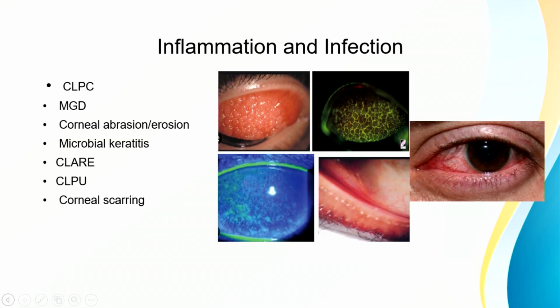deposits get deposited on the contact lenses, where they come and rub with the palpebral conjunctiva and cause all these giant papillae. The patient will be asymptomatic, then slowly we can see discomfort in the patient. One classic thing where we can find the giant papillary reaction is, if the patient is wearing contact lenses, you can see the movement of the lens. If they have such big papillae, the lens will move along with the lid. So when they close and open, the lens will be pulled up along with the lid as well.